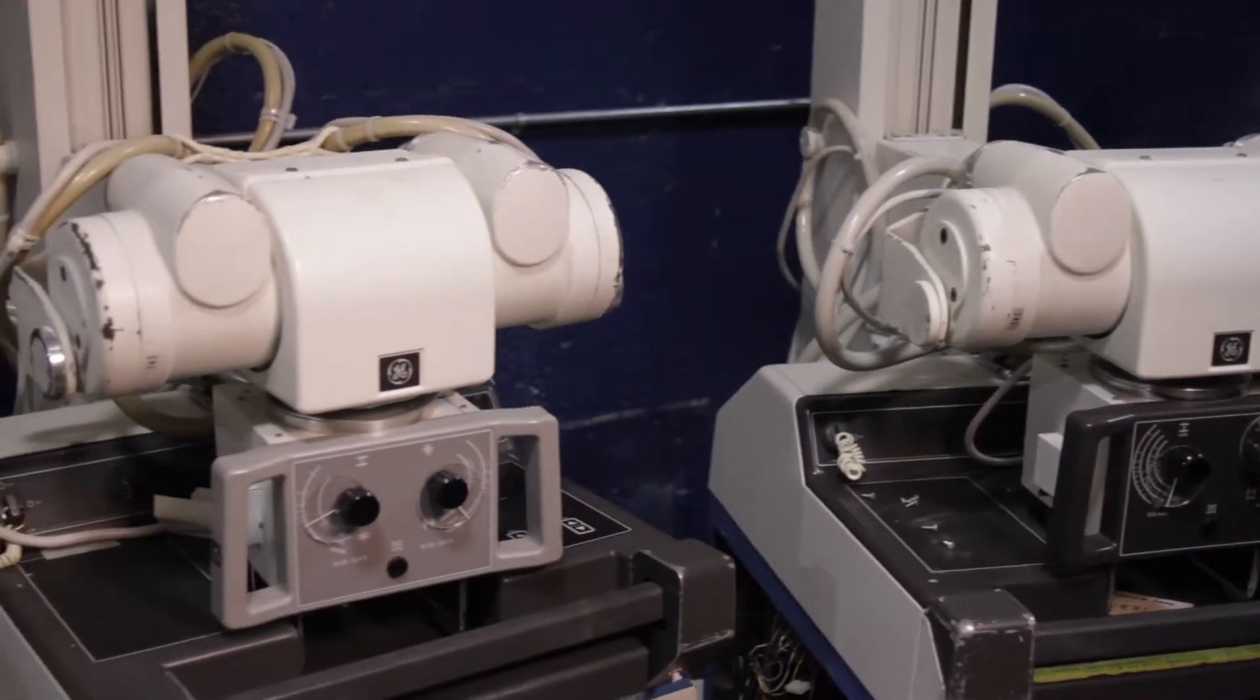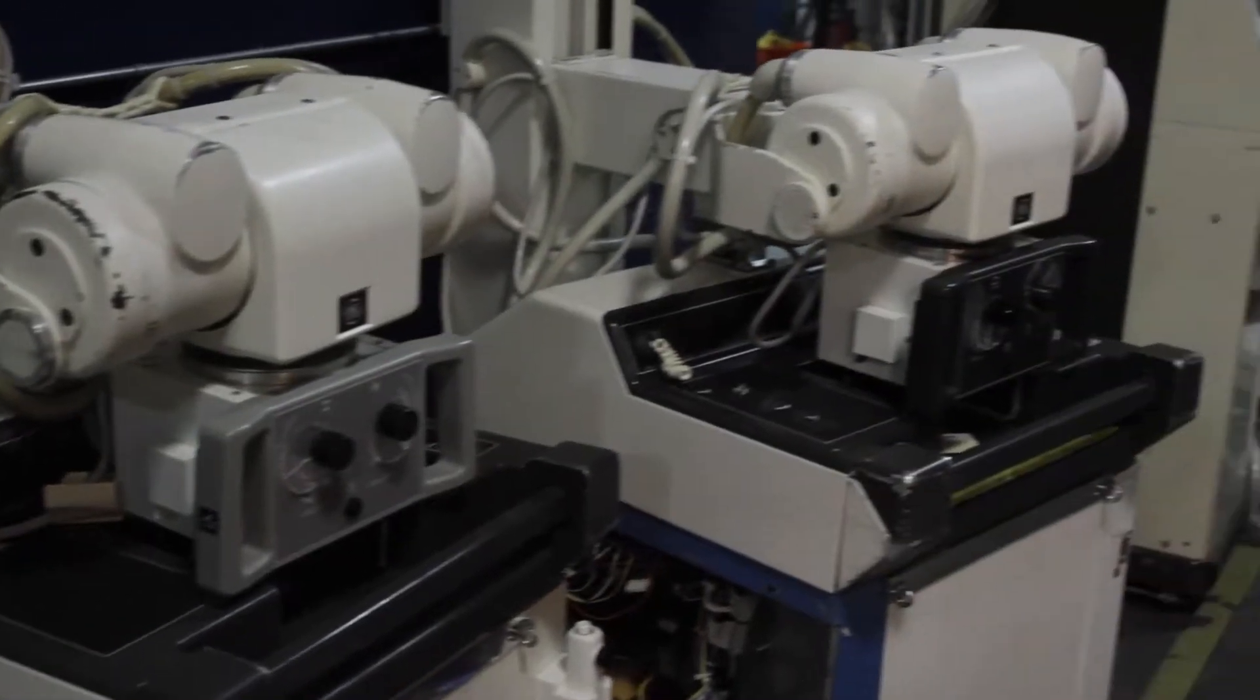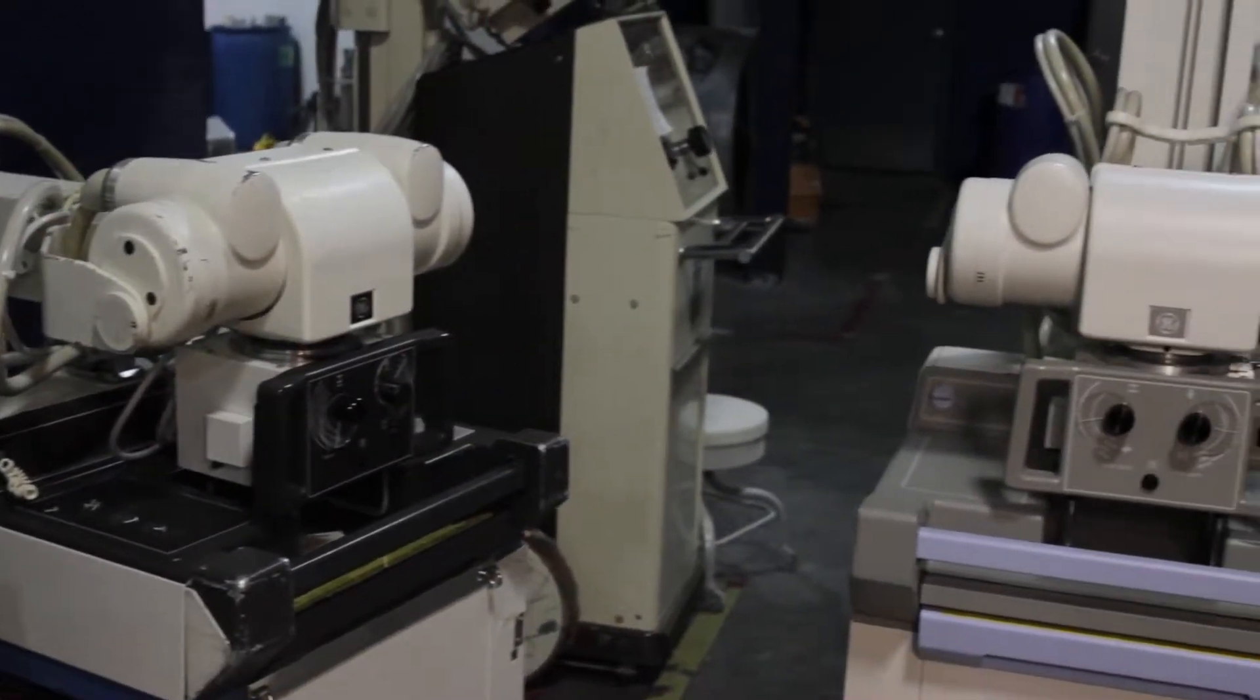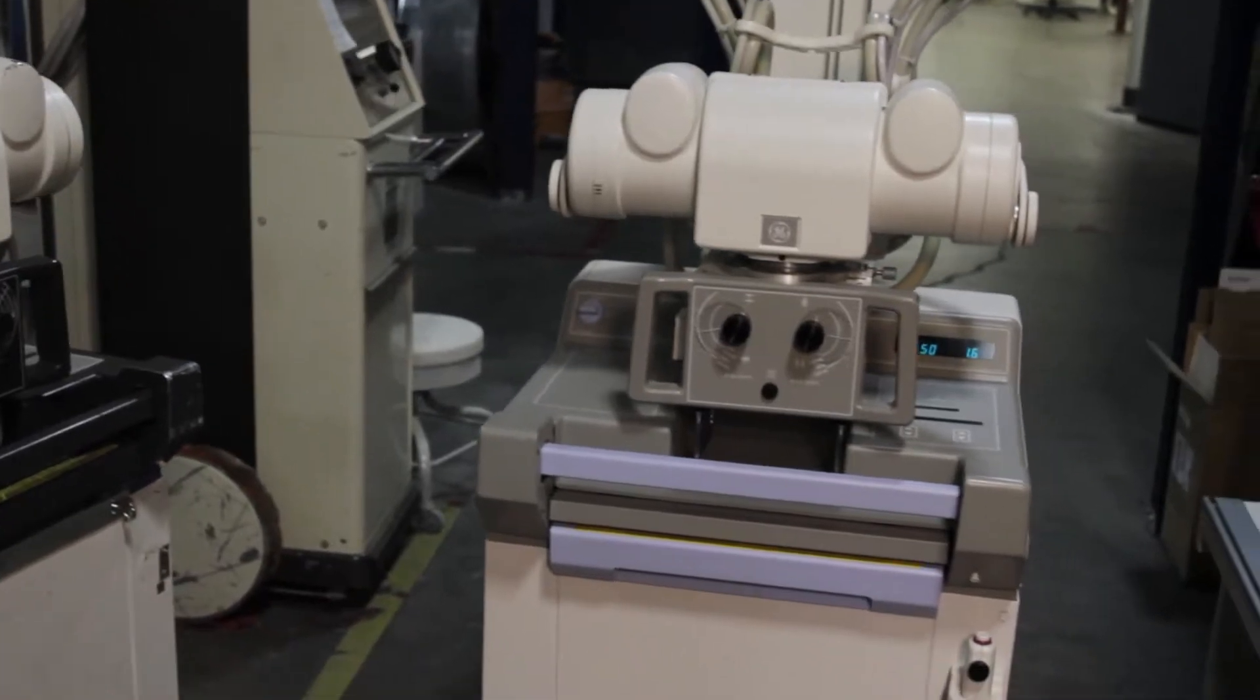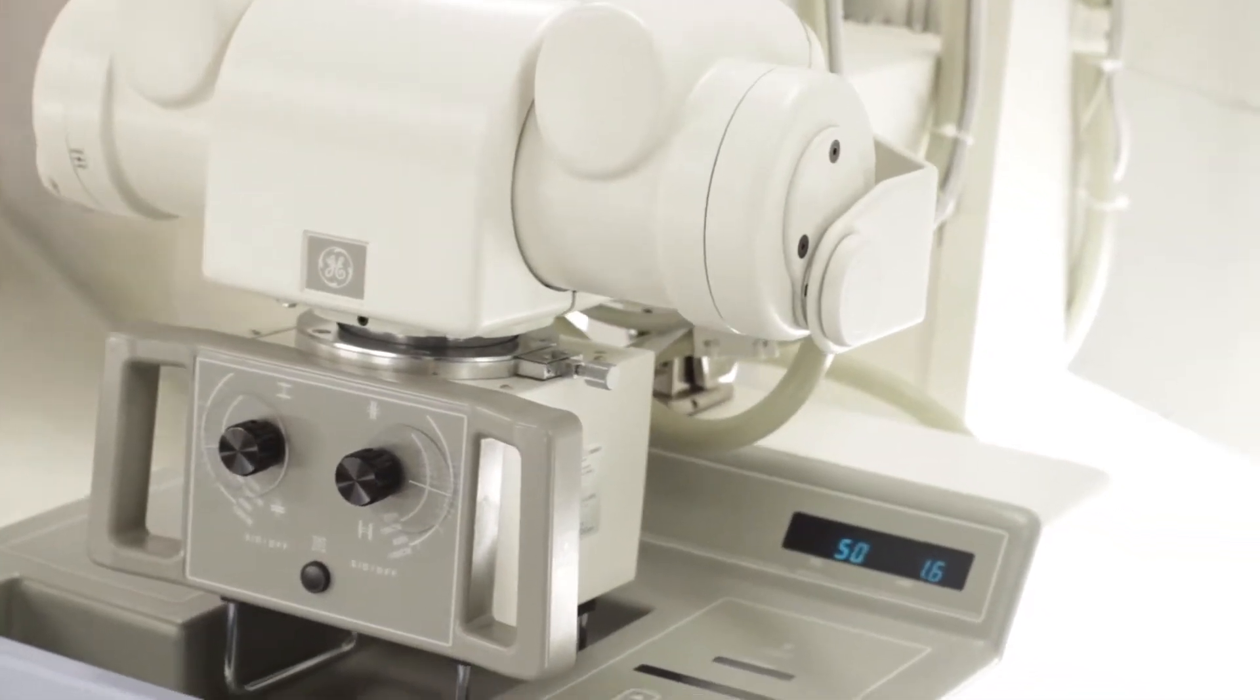This AMX4 is what many systems in the field look like after years of use. RADSource utilizes our disassembly, painting, testing, and reassembly process to bring the equipment to like new condition, both aesthetically and functionally. Here is how an AMX4 looks after being worked on.